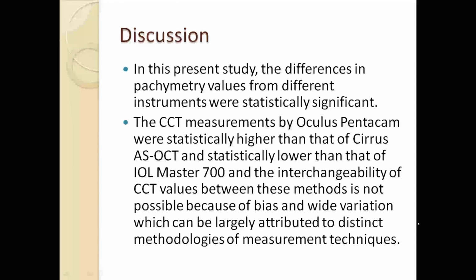In the present study, the differences in the pachymetry values from different instruments were statistically significant. Hence, the CCT measurements by Oculus Pentacam were statistically higher than those of Cirrus ASOCT and statistically lower than those of IOLMaster 700. The interchangeability of the CCT values between these methods is not possible because of the bias and wide variation, which can be largely attributed to the distinct methodologies of the measurement technology.